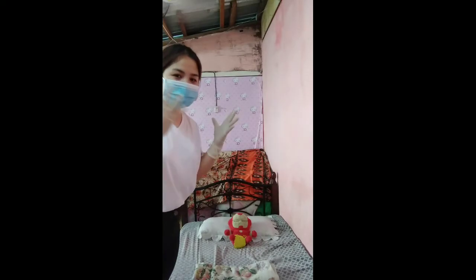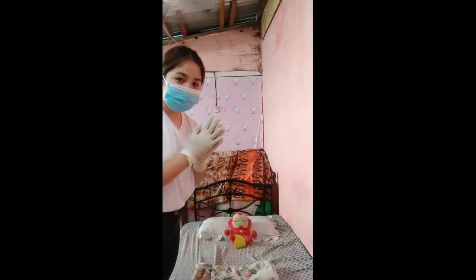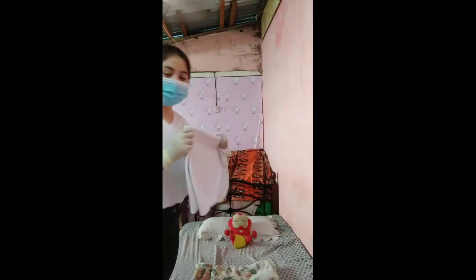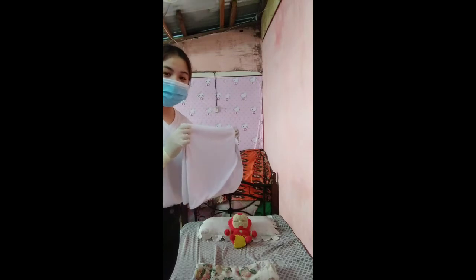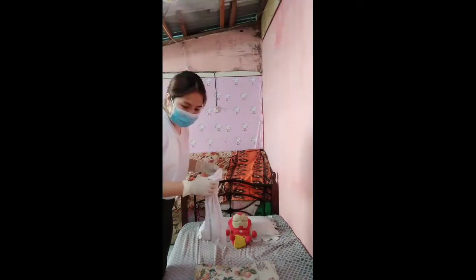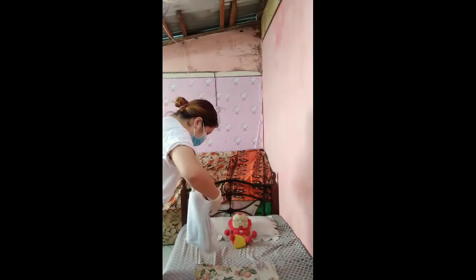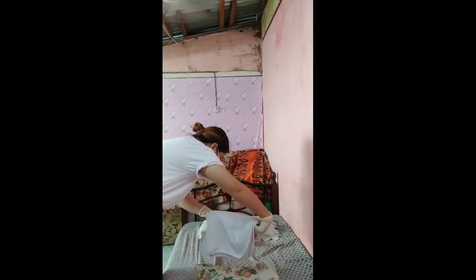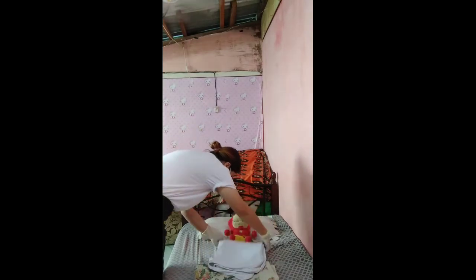So after putting the sterile gloves on our hands, we need to put the sterile drape under the patient's bottom. So I have here an improvised sterile drape. This is a sterile drape. See? So ma'am, can I ask you to raise your hips so that I can put the sterile drape under your buttocks? So here.